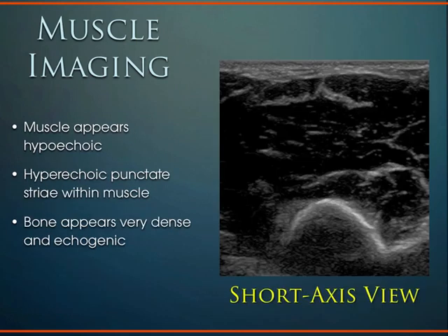That was a longitudinal view. This is short axis view or transverse or axial view, different terms for that. Again, more hypoechoic muscle structure. This is the deep bony structure here. So superficial, that is the muscle, and these are these connective tissue dots that in short axis view are referred to as a starry night pattern. You'll hear that term tossed around when looking at short axis view for muscle, as that starry night is just that interwoven connective tissue.